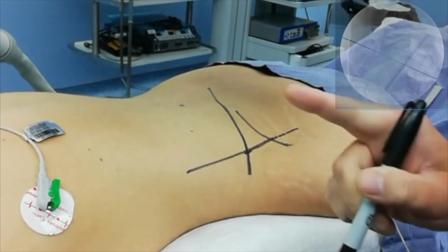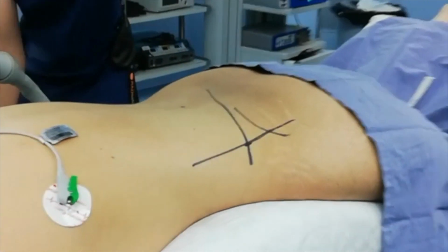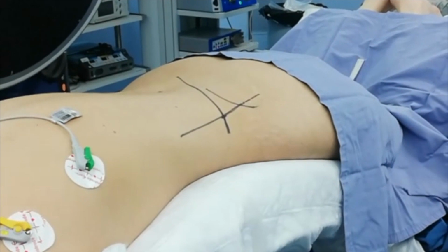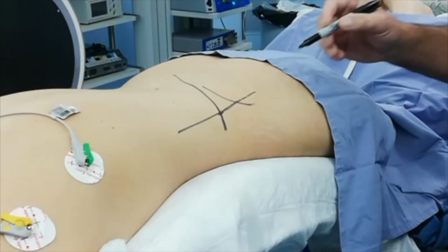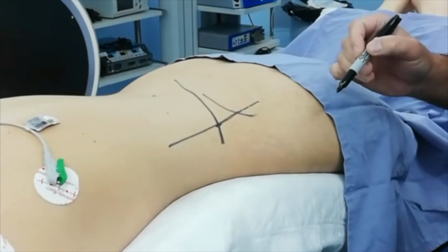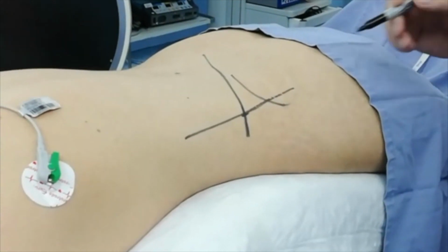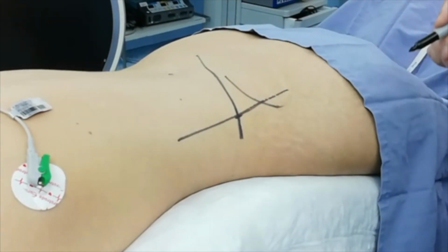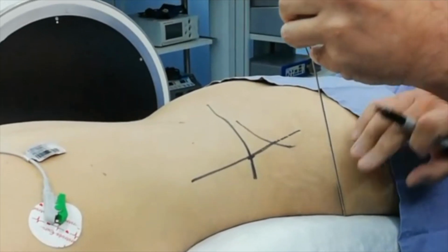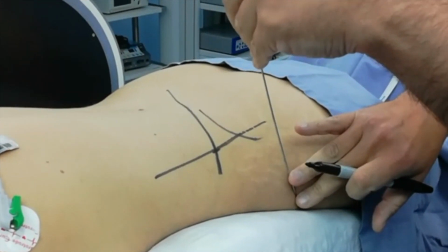Now we need this last line, which is the lateral line. Lateral, X-ray please. So the idea is that the AP and the lateral lines will meet at a point on the 12 centimeter parallel line for L4, L5. So the AP and the lateral line, which I will draw now, will meet at the 12 centimeter parallel line. And this is my true lateral line. The patient has mild scoliosis, so we just accounted for that on a true lateral projection.